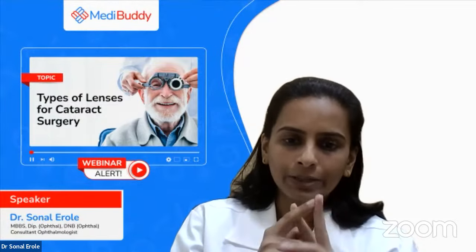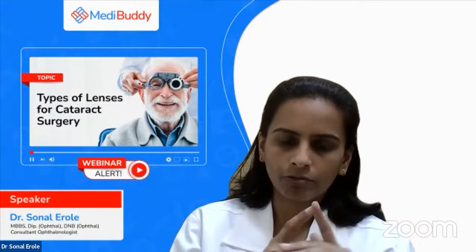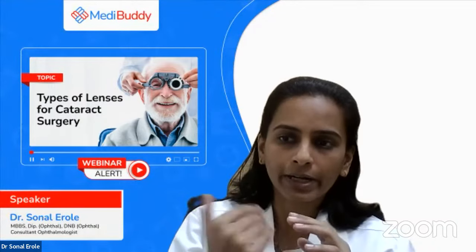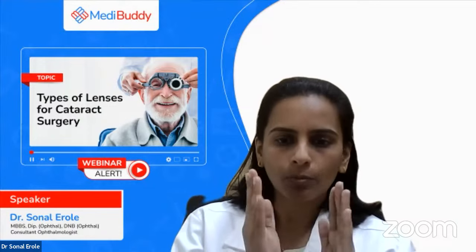Then comes the multifocal lens. With the monofocal lens, people wanted to see with the same lens for distance, near and intermediate, so scientists came up with the newer concept of the multifocal lens.